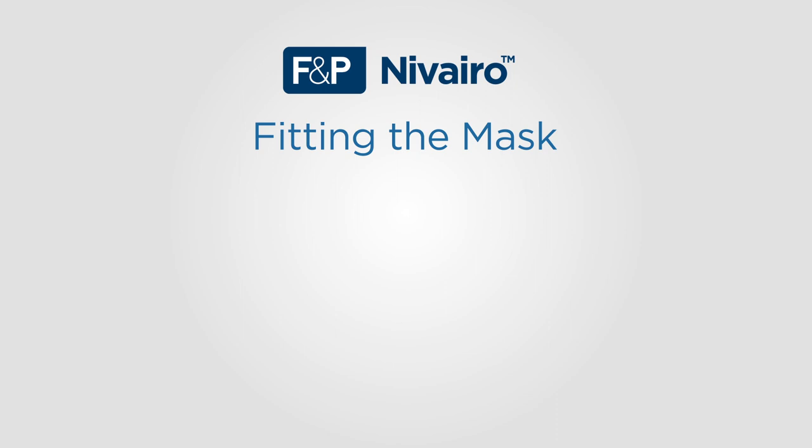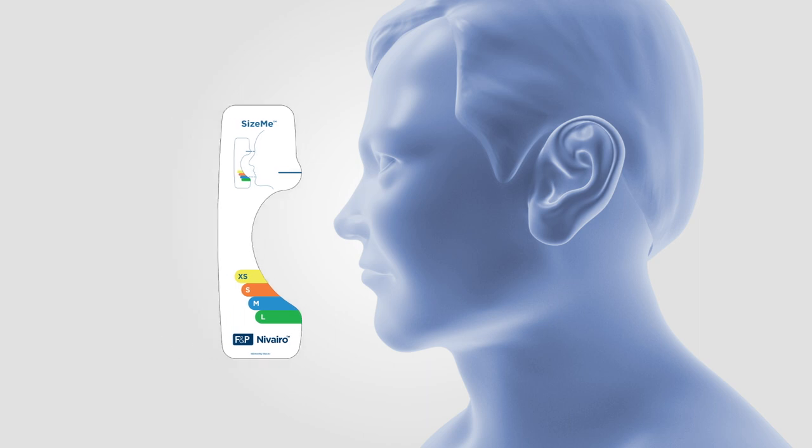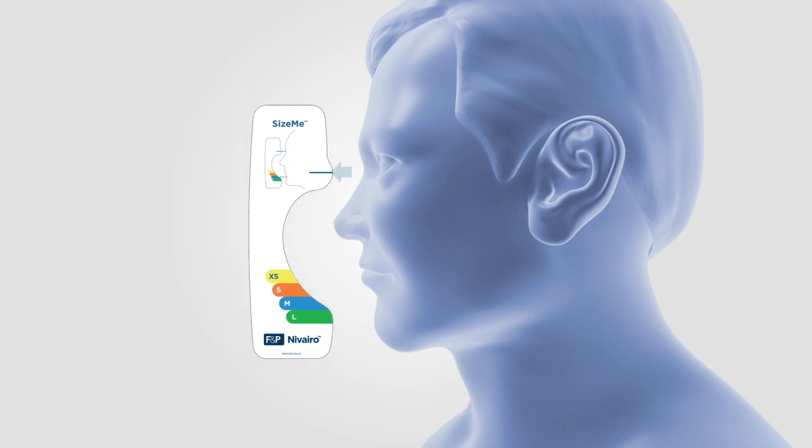We will now discuss how to fit Navarro Non-Invasive Full Face Masks, starting with how to select the right sized mask for your patient. Place the sizing guide provided on the face. The blue line of the sizing guide should be between the eyes at eye level. The correct mask size is measured just below the lower lip on the chin. In this case, the patient is a medium size.